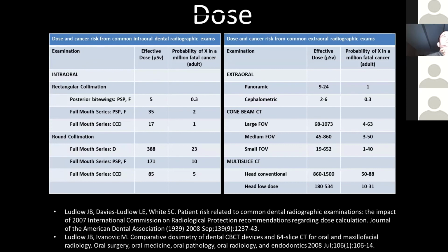And I do believe that if you have a patient that just cannot tolerate intraoral radiographs, the extraoral bite wings are your next step. Cone beam CT is too much. And again, the resolution there for small, kind of incipient caries detection isn't quite good enough.